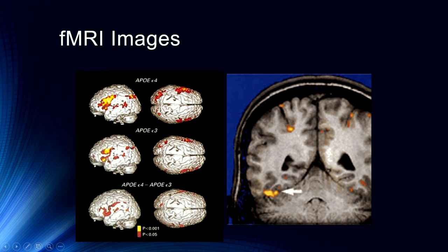And so we have these statistical parametric maps for the task involved, and then in this last one, these are the SPMs comparing these two particular genotypes. So this is a complex methodology where we're doing genotyping along with fMRI work, and then we've placed those differences in these voxels on this parametric map. And of course, you can see here we put it in a slice, versus here we put it on the surface of the cortex. And so you can see these areas where there's been differences in the functioning of these particular individuals.